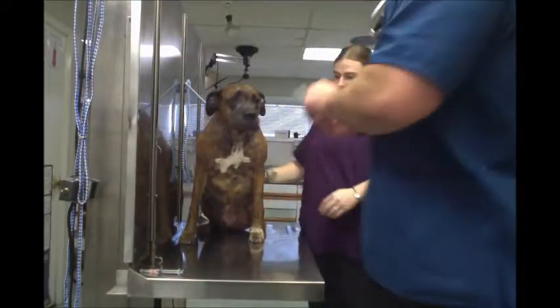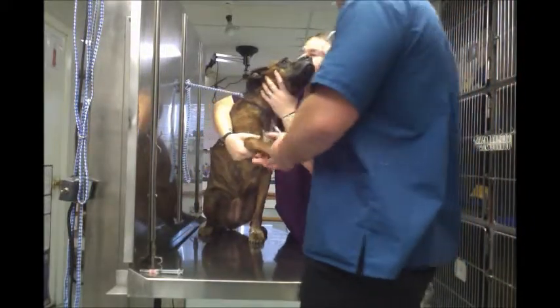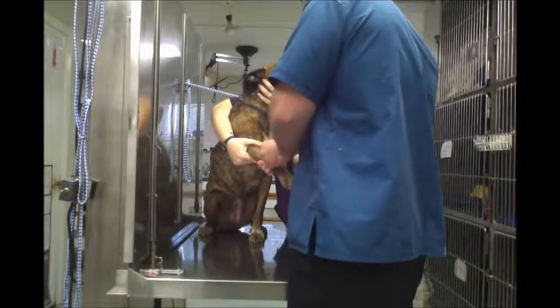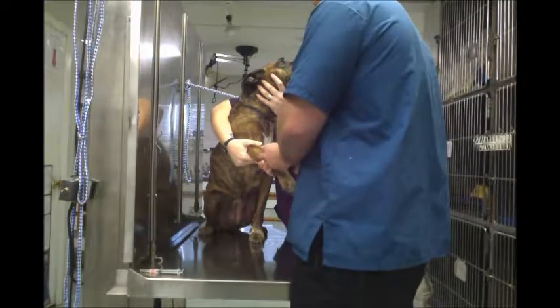Alright, intravenous, we're gonna have Megan restrain her here. We're gonna go for the cephalic vein. We're gonna want to make sure to pull back on the syringe to make sure that we're actually in the vein. And then we're gonna go ahead and give that.